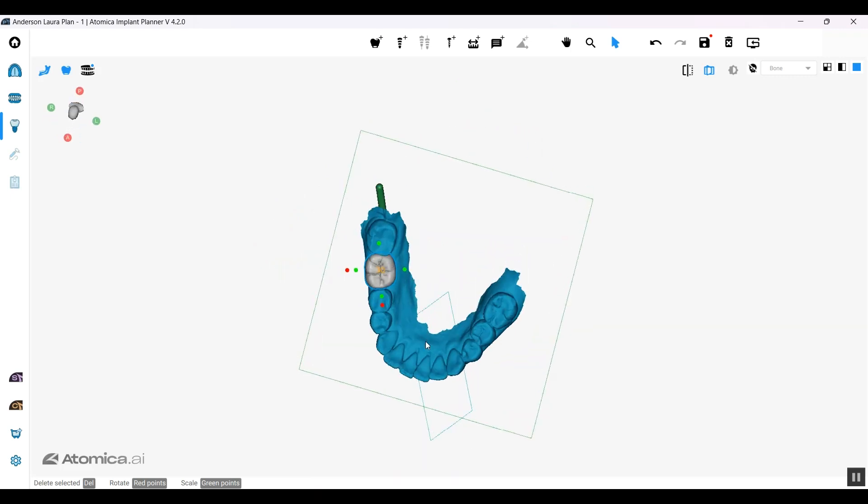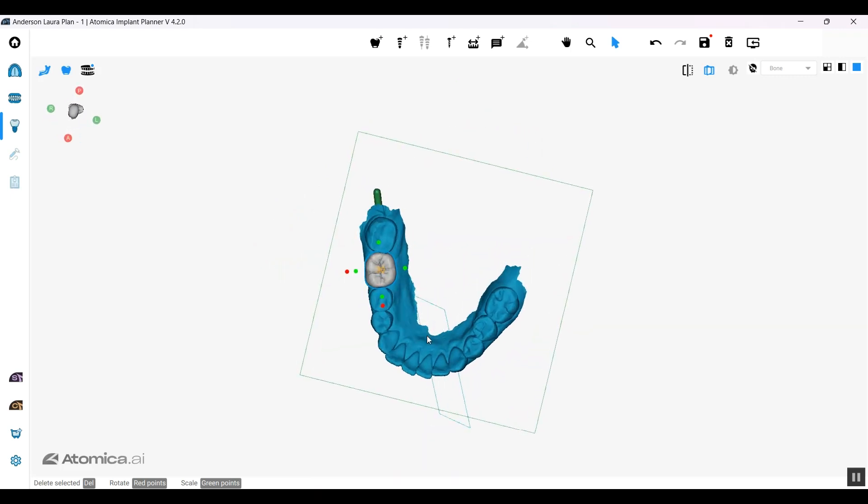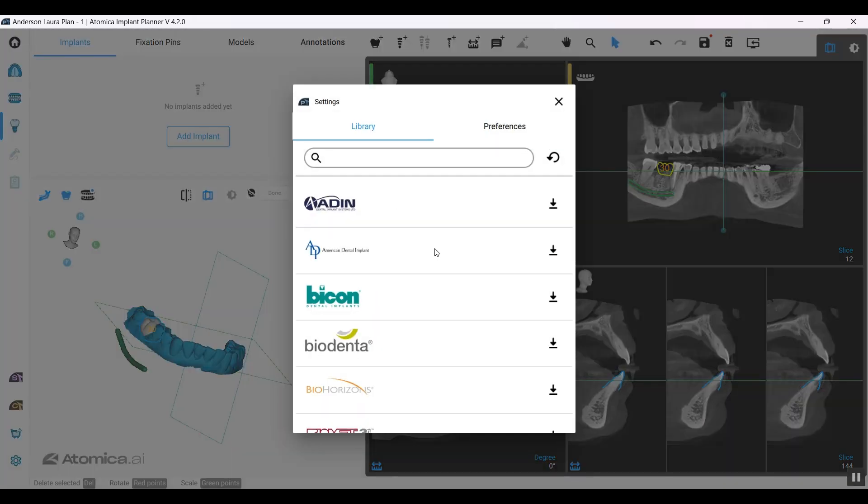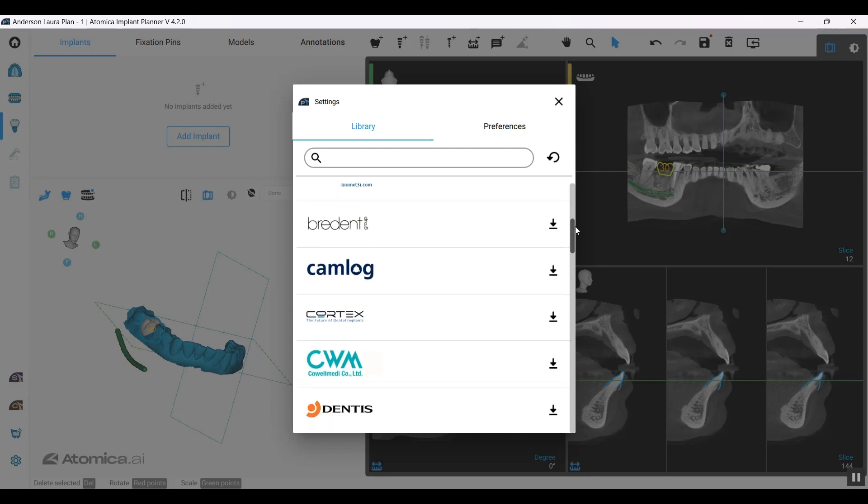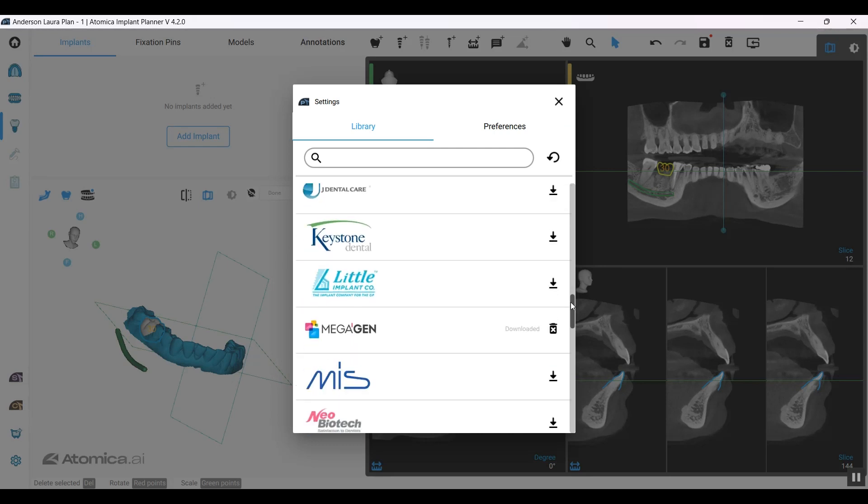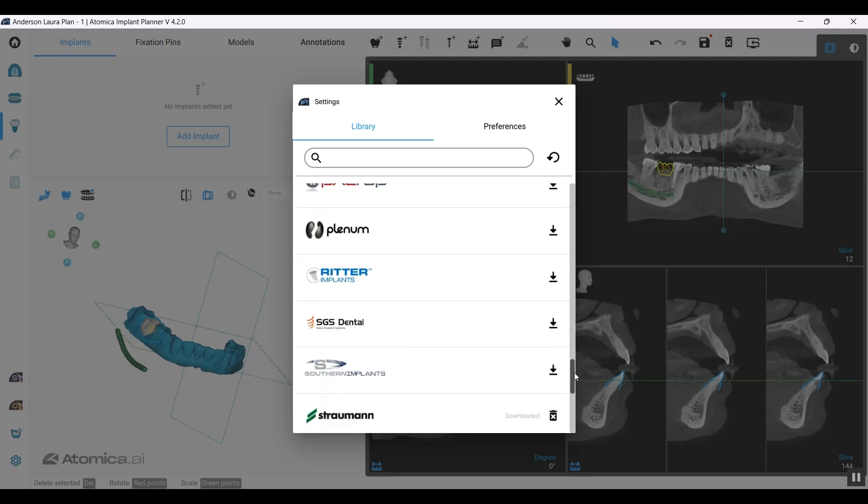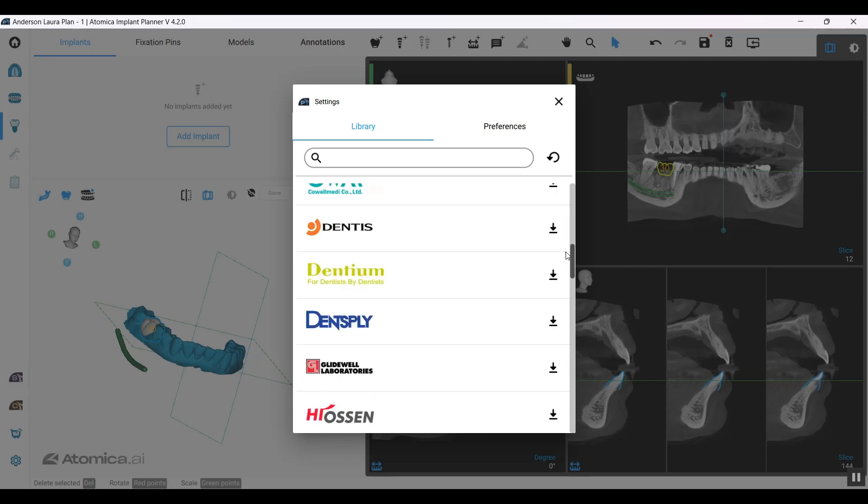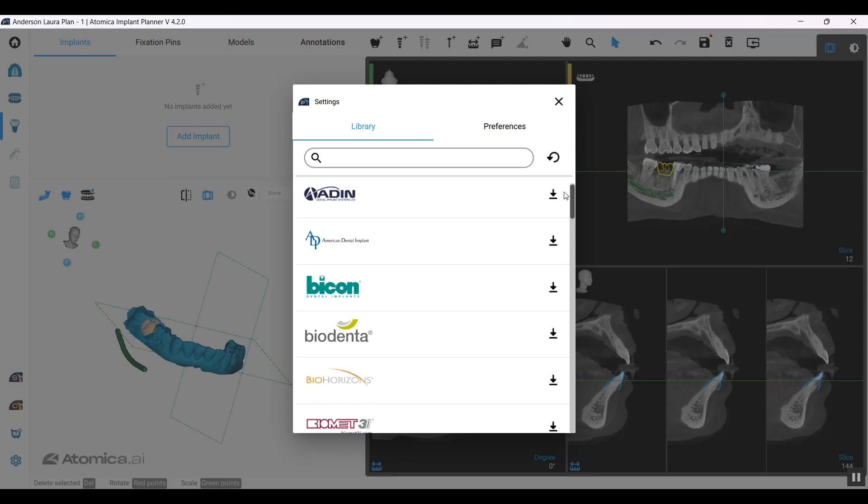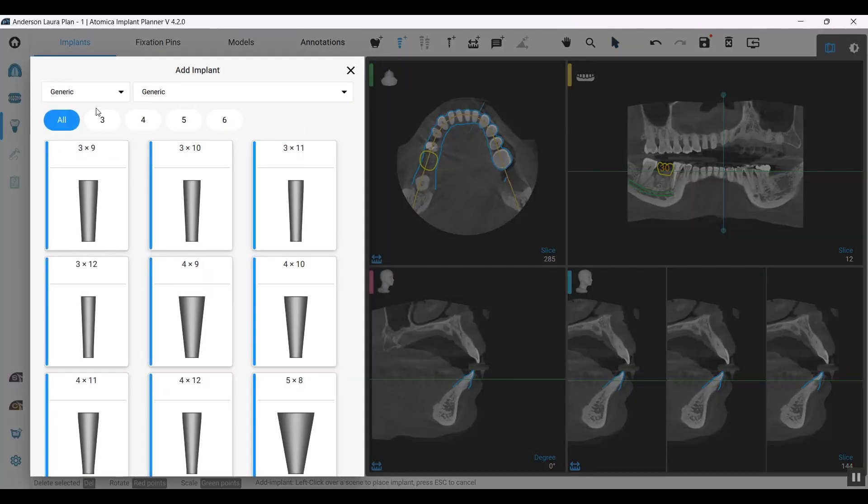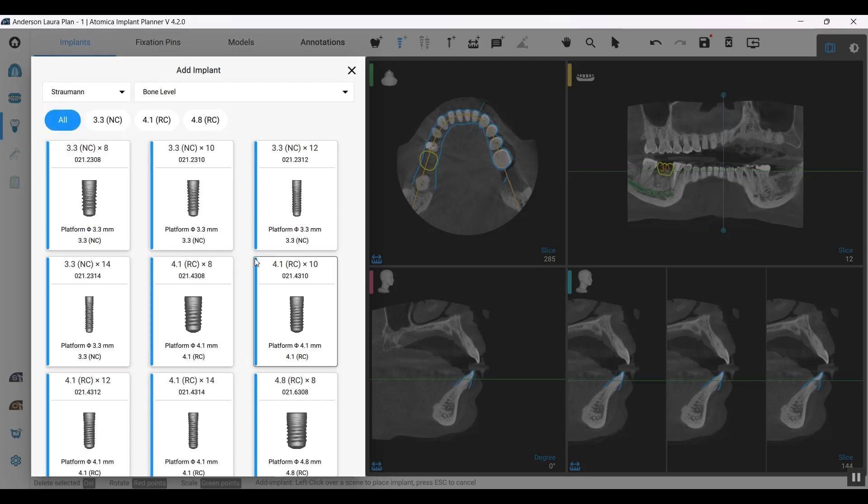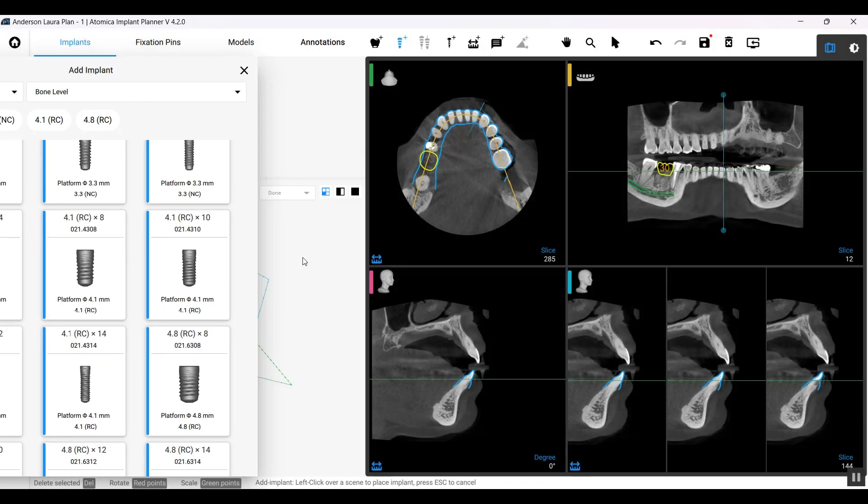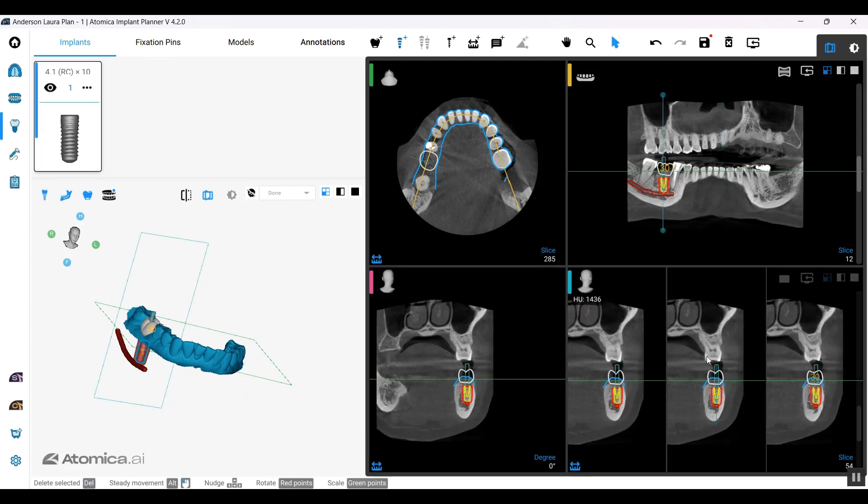Let's go ahead and start adding our implant. We have a lot of available vendors, varieties of implant systems that I'm sure you'll be able to find your system that you're working with. It's all pre-downloaded, and you can download it all at once. Once you start selecting your implant, you'll find it up there. I only downloaded Megagen and Straumann, so let's take Straumann as an example.